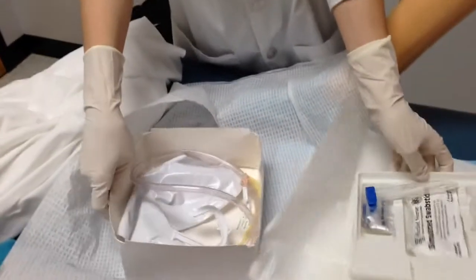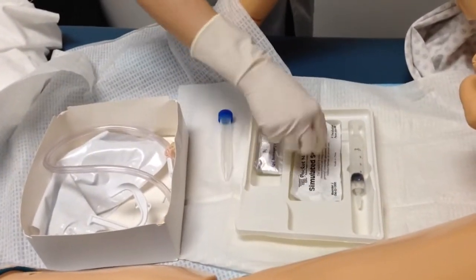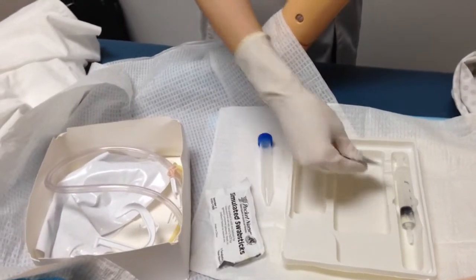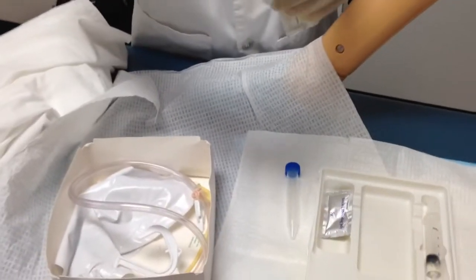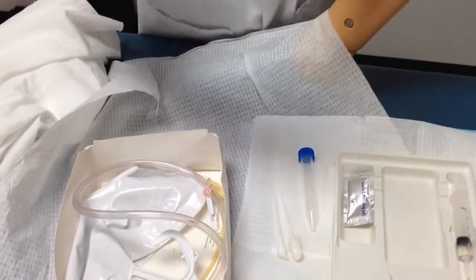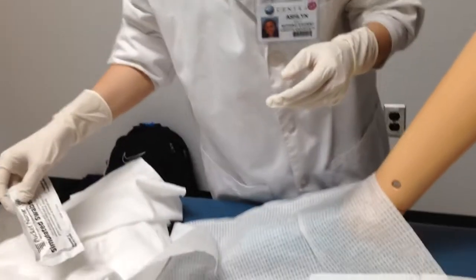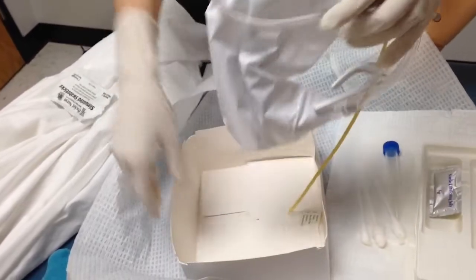bit here. And what I'm going to do first is take out the lubricant and squirt it out into the container and take my swabs out. Watch your border. Alright, and I would dispose of this in a trash can that would be near me. And then I'm going to go ahead and take out the catheter itself.